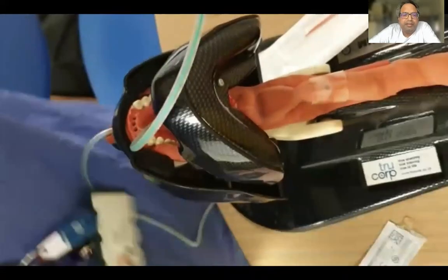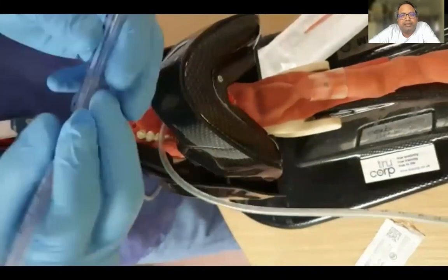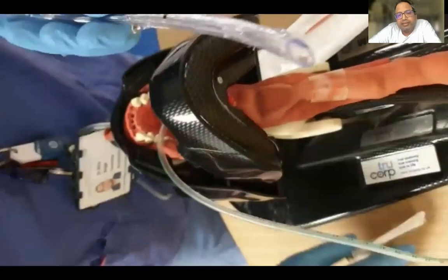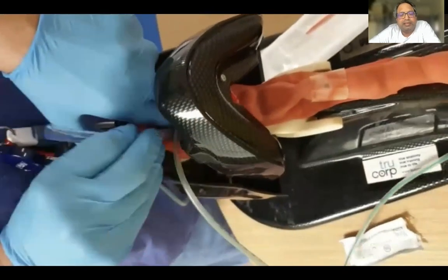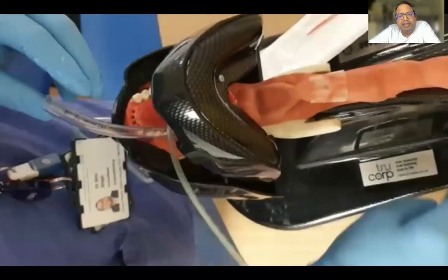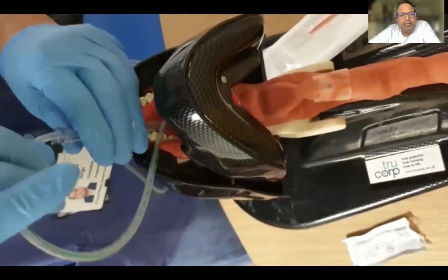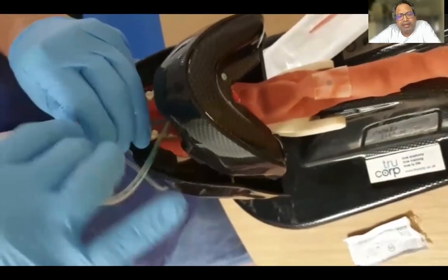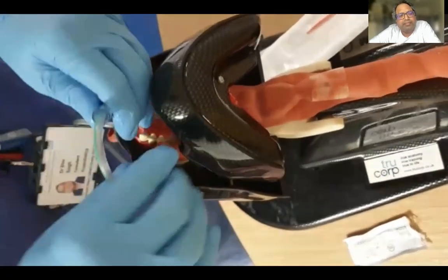The next thing we need to do is to take our split endotracheal tube and jelly that as well and insert it into the esophagus. It will go in straight into the esophagus. And through this, you thread your NG tube in. Thread it all the way. Take a good length of it so that you have a decent amount of length in the esophagus.